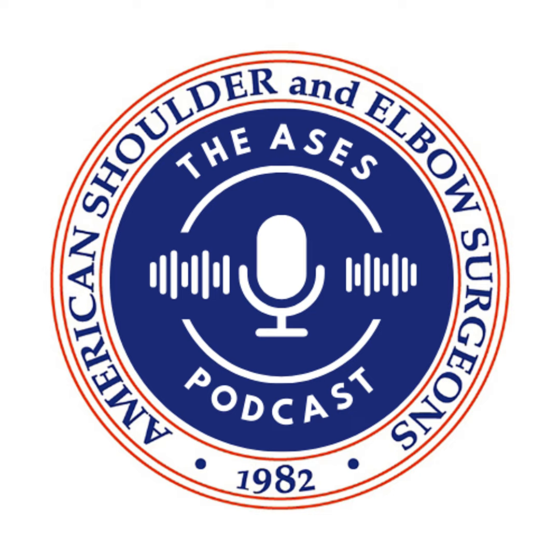So yeah, I've been using the robotics platform at this point, using the ROSA shoulder system for the majority of my cases that I feel any need for PSI or anything else. So I've kind of abandoned PSI at this point. The robot, obviously, is a little bit more time friendly. I can get my CT scan and plan it and execute the case that day or the next day, as opposed to having to wait for a 3D printed guide, as you mentioned.